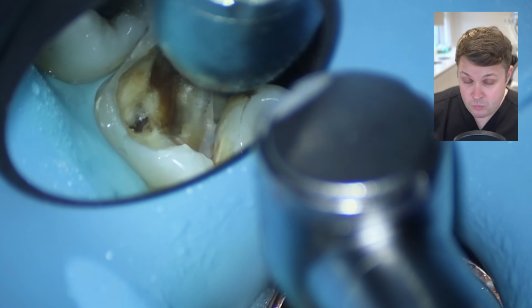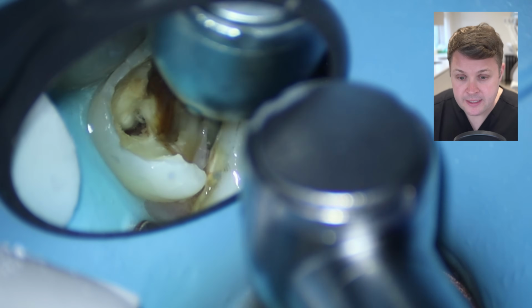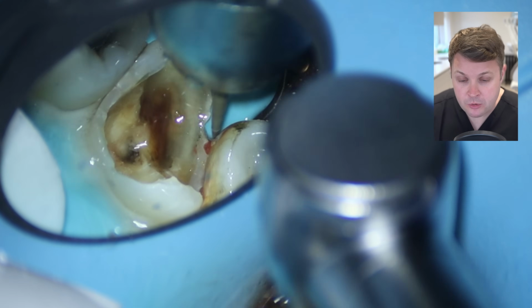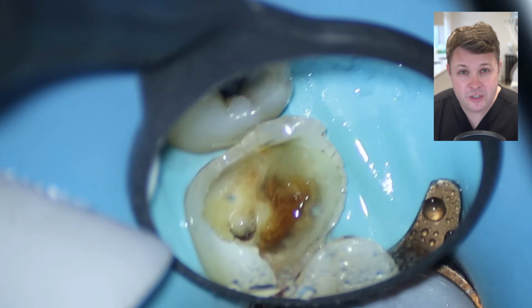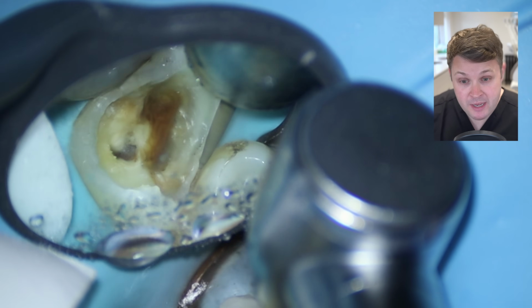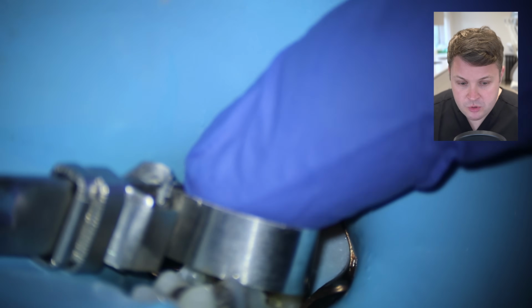The problem with this, of course, is it's really, really difficult not to damage the tooth next door to it. So you're just being really, really careful. I'm just very, very gently opening up the contact. Also, I don't want to remove too much because it's harder for me to place the contact back, especially with the matrix band. But once we remove the contact point, the matrix band goes on quite nicely.